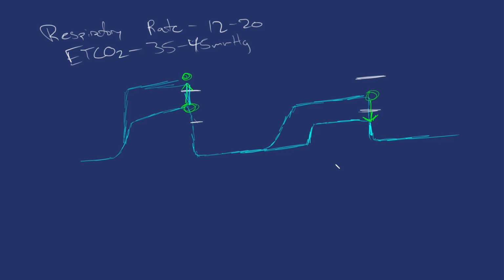That can mean we have some kind of imbalance, such as a respiratory acidosis, metabolic acidosis, etc. And that's the point you'd start moving towards ABGs and kind of narrowing down what's going on.